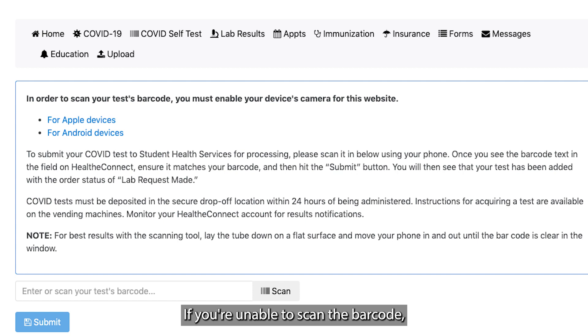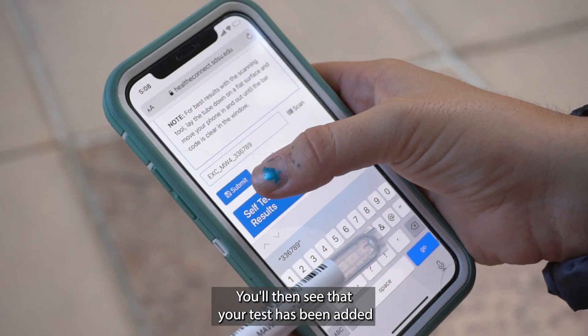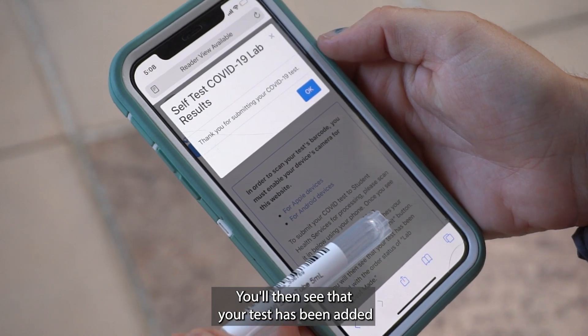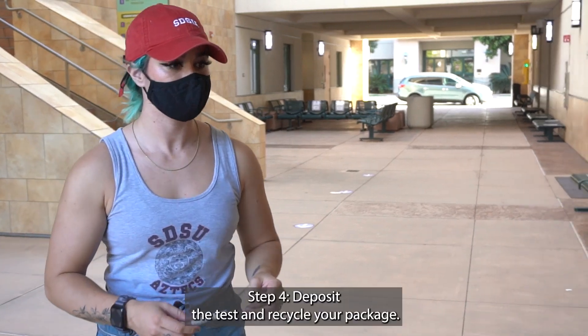If you're unable to scan the barcode, be sure to enter the 12-digit number starting with EXC. You'll then see that your test has been added with the order status of "lab request made."